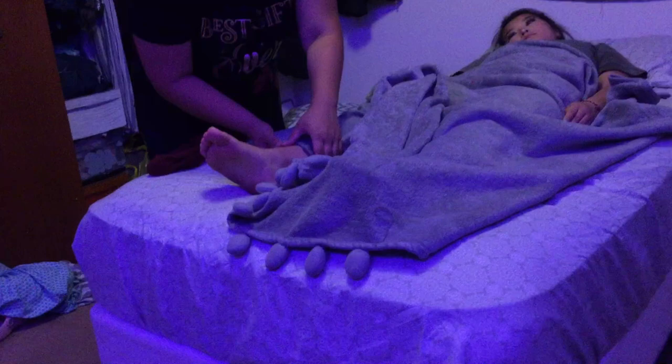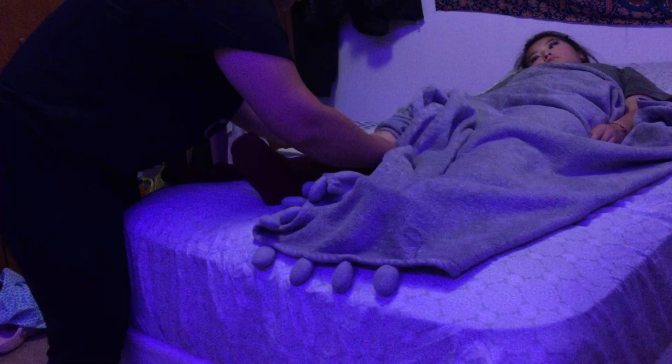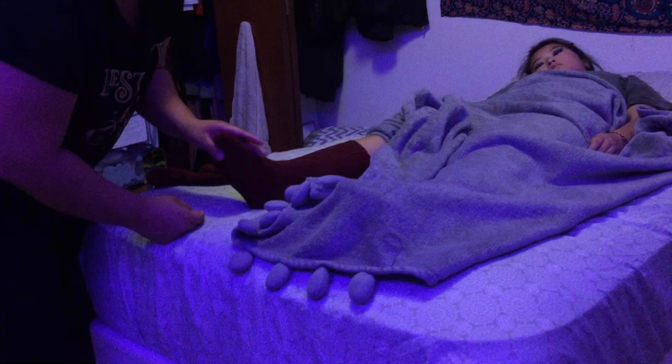So what I'm going to be doing is I'm just going to be exposing one leg at a time and just putting on your sock here. So I'm just going to lift this up a little bit here. I'm just going to put this right on there and roll this up. Just want to make sure everything's smooth.